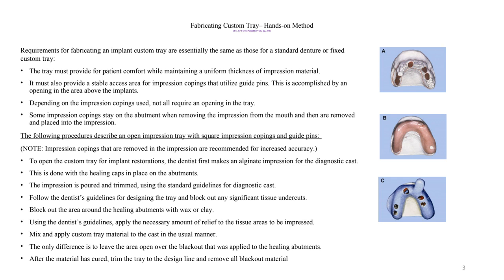Impression coppings removed from the impressions are recommended for increased accuracy. For the open custom tray for implant restoration, the dentist first takes an alginate impression for the diagnostic cast, done with healing caps in place on the abutments. The impression is poured and trimmed using standard guidelines for diagnostic casts. We have to follow the dentist's guideline for designing the tray and block out any significant undercuts. It's very important to block out the area where the healing abutments are, because if we don't, the impression material gets caught in there and might move the implant or distort the setting.